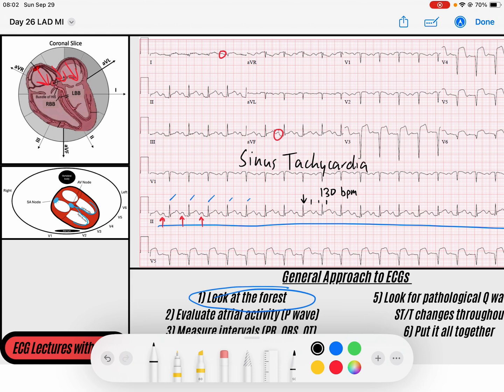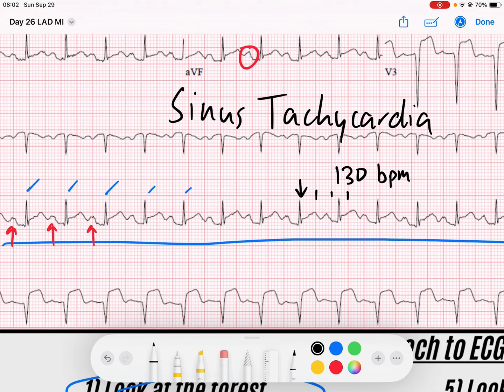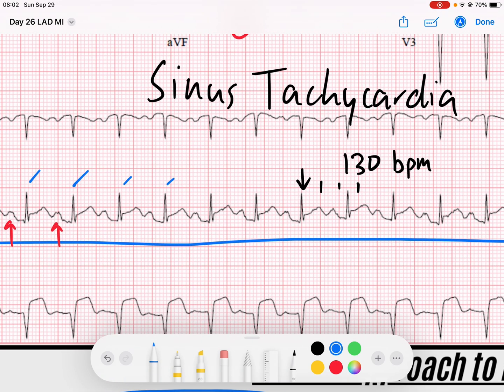The next thing I need to do is determine how my AV node is functioning, so I look at my PR intervals. Remember the AV node takes that P wave and transmits it to my QRS, to my ventricle — so PR intervals are a surrogate for AV node function. From the beginning of a P wave to the beginning of a QRS, my PR interval is right at the upper limit of normal, which is 120 to 200 milliseconds — about 200 milliseconds here.